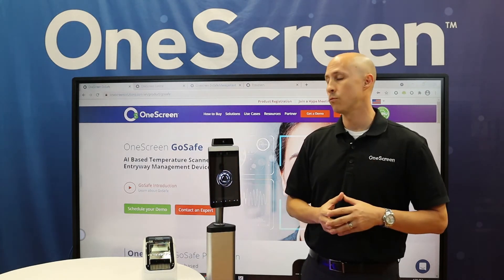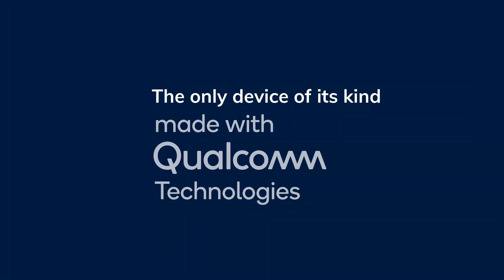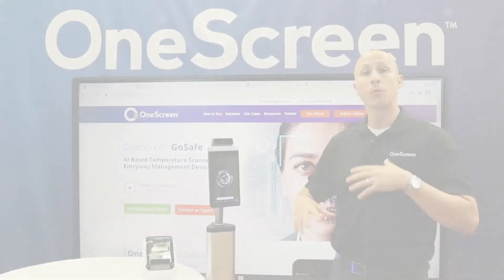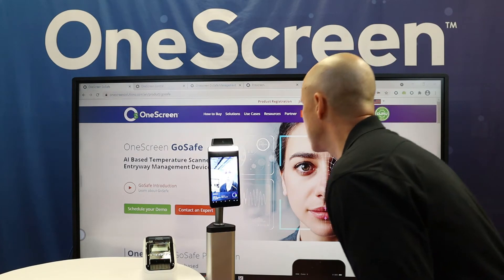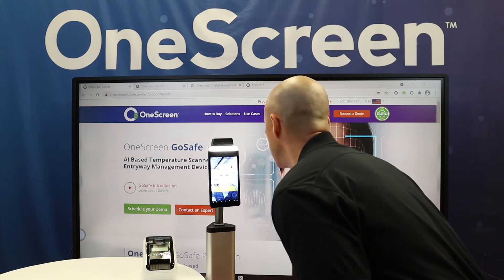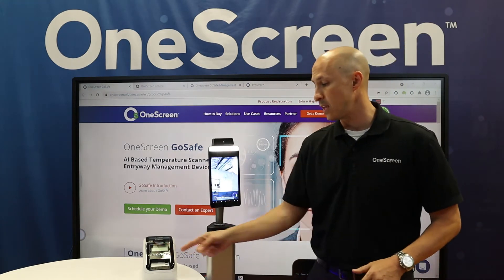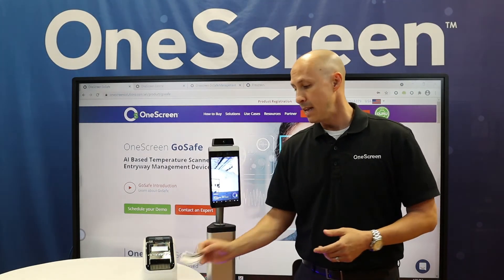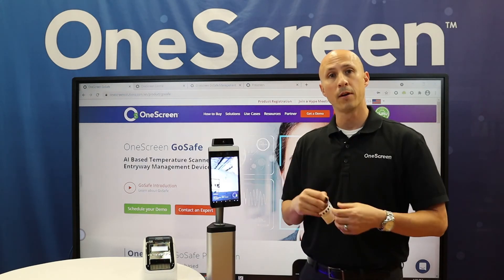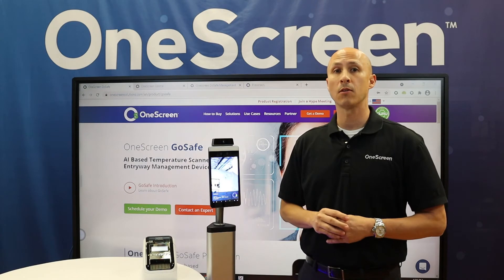Let's go ahead and do a real quick test drive and show you how this works. Remember, we are the only product with the Qualcomm chipset built into our device, so we do have the fastest, most reliable, and most secure unit out there. All I have to do is get in front of the device — it recognizes me and the light turns on. It's admitting me with my temperature, and as you can see, within a second or less, the printer is already printing out that badge. All I have to do is whip off the backing, put it on my chest, and I'm good to go throughout the rest of the facility.